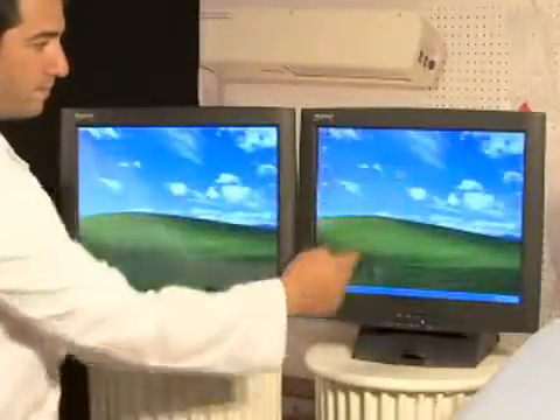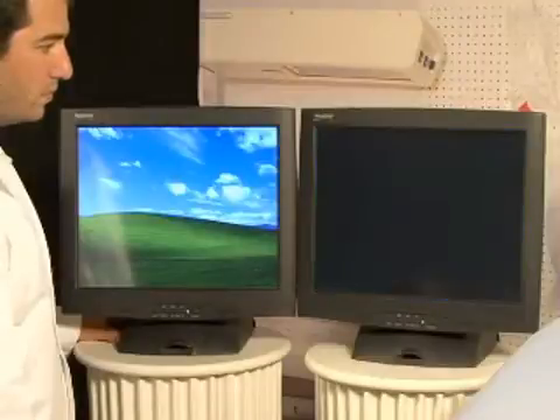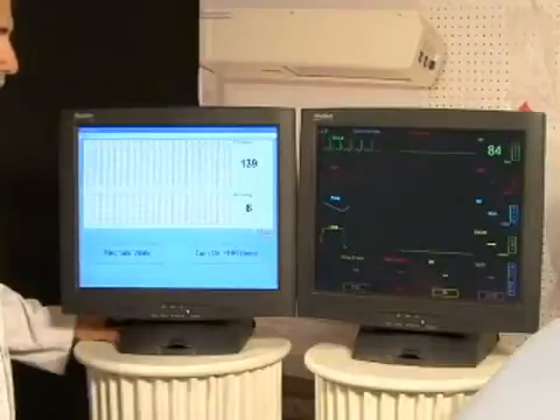Unpack both touch screen monitors and connect them to the desktop computer. The GOMARD monitor software will be connected to the GOMARD UI controlling software when they are initialized.